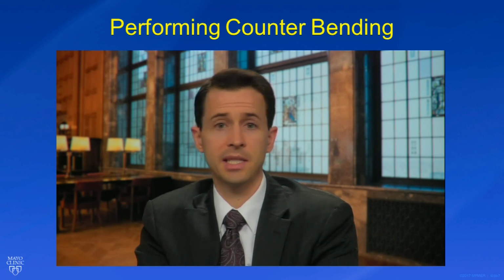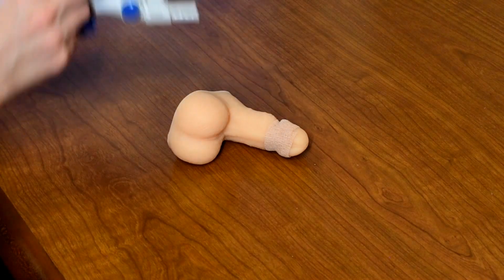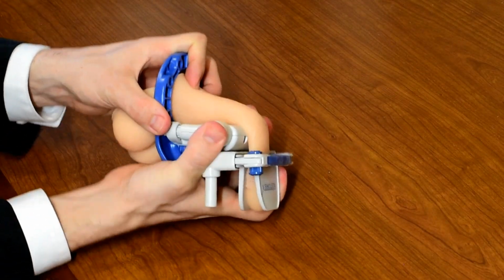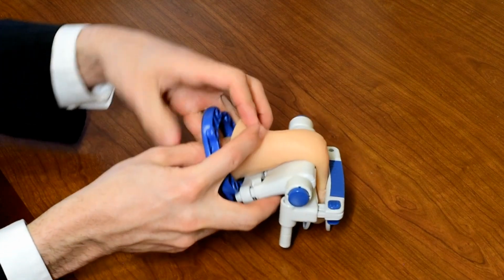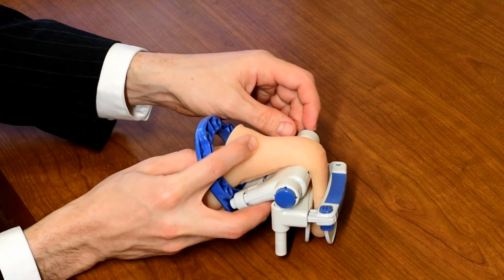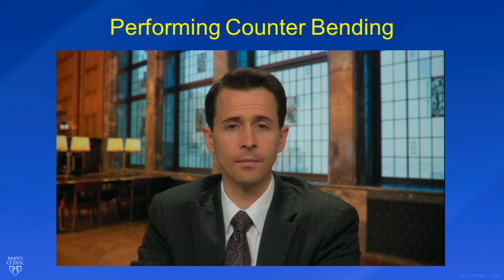Now if you find that the penis is simply not long enough to achieve counterbending to the 3rd or 4th position, make sure that the clamp housing is set to the closest position possible. Even if your curve is closer to the base of the penis, it's often more important to achieve counterbending to the 3rd or 4th positions rather than to have the bend over the fulcrum. The goal of the fulcrum is to apply more traction to the side of curvature than the other regions of the penis. It is not essential to have the side of curvature immediately over the curve itself.